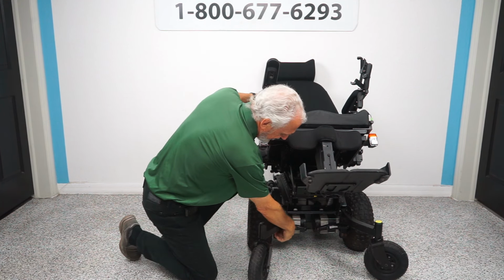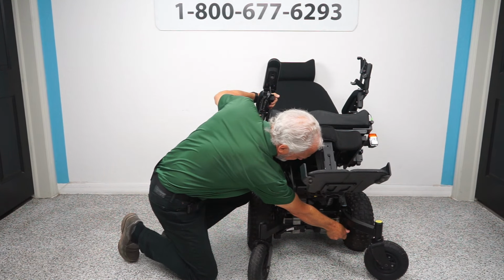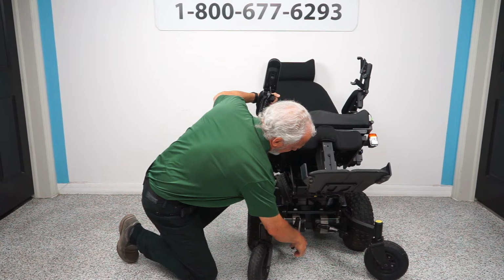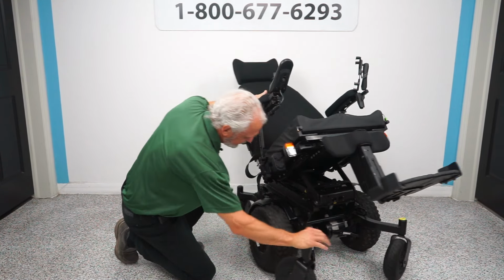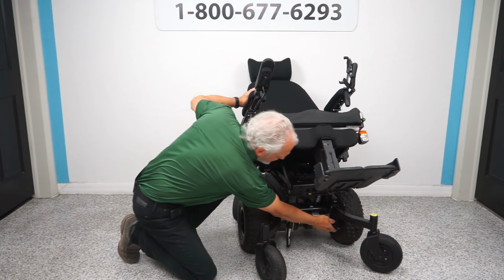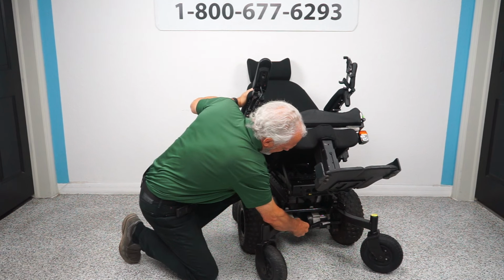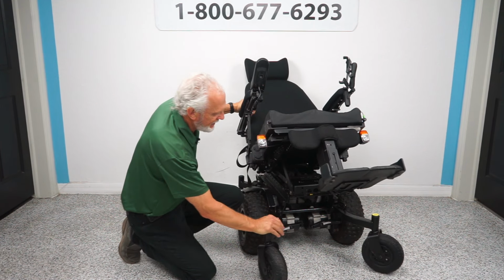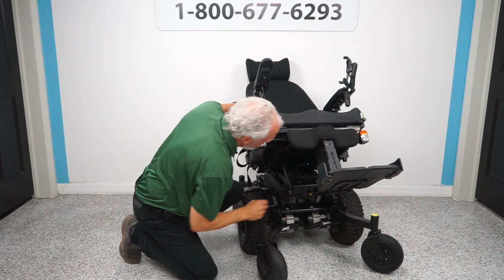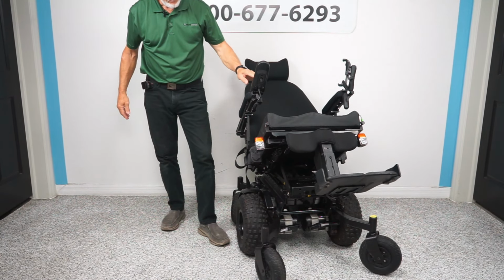Each of the motors has a big handle. If I push that handle down, okay, and push this one this way, the chair will be, actually the thing came off of here, but anyway, you can see the chair is in neutral. That's how you put the chair in neutral when you want to roll. Then you just push it back like that. I had to put that handle back on there. And now you're back in gear. And then you can turn your power on. So these two handles will turn the motors in neutral. Let's bring the tilt back down since we've done that.